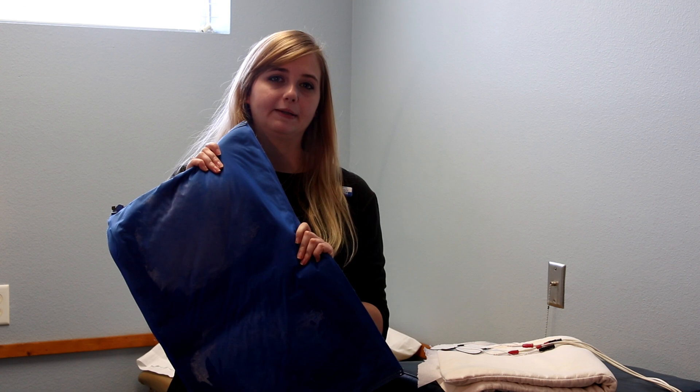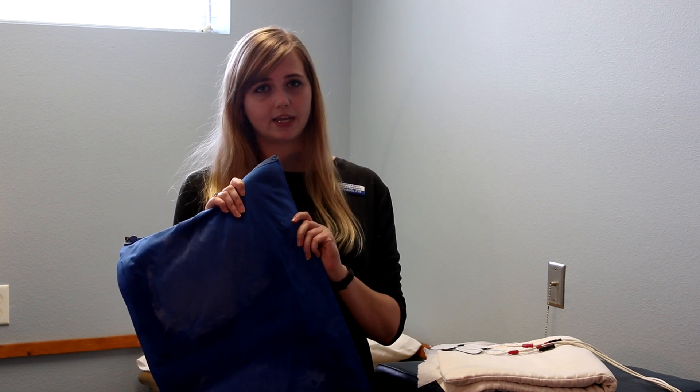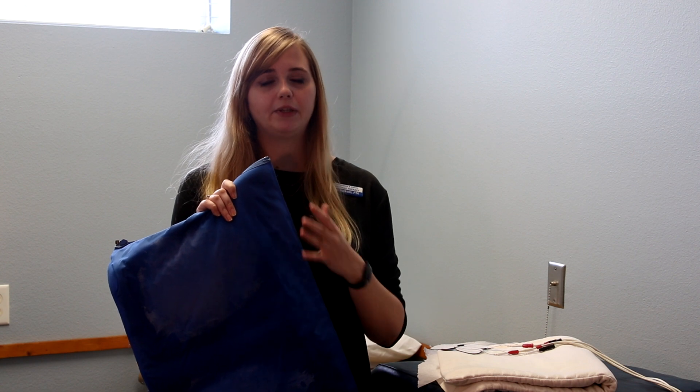At the end of your treatment, we may give you a cold pack. You never want to place a cold pack directly on your skin. You always want to have a layer between you and it, whether that's a pillowcase or some towels, just depending on your tolerance to the cold.